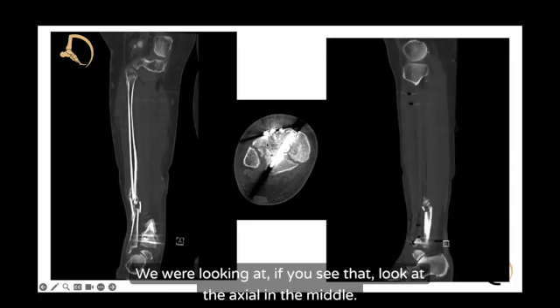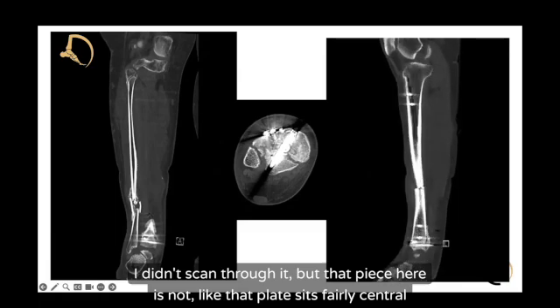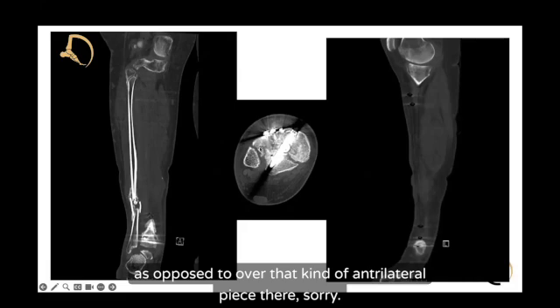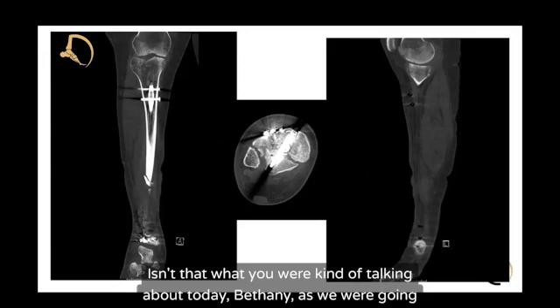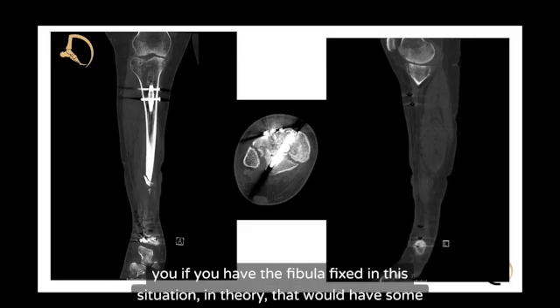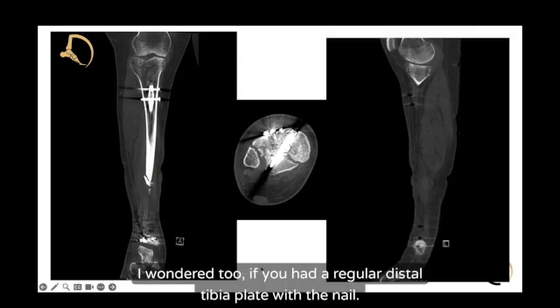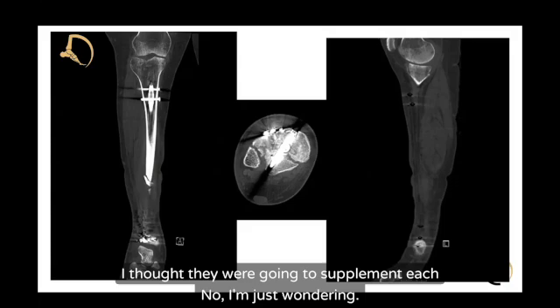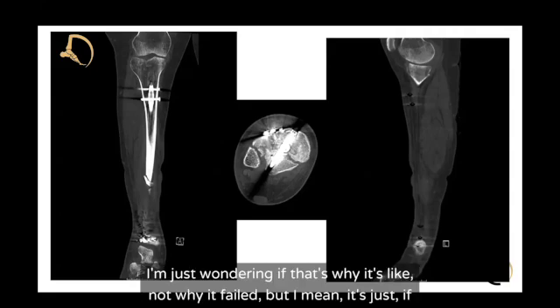Looking at the CT scans, including the axial cuts — that anterolateral piece was not really captured. The plate sits fairly centered as opposed to over that anterolateral piece. If you had the fibula fixed in this situation, in theory there would be ligamentous attachment to that piece as well. If you had a regular distal tibia plate with the nail — wondering if that's related to why it failed — because I would not expect this to fail. I've treated many of these with just screws in the joint and the nail going just above the joint, and I've seen them heal without issues.